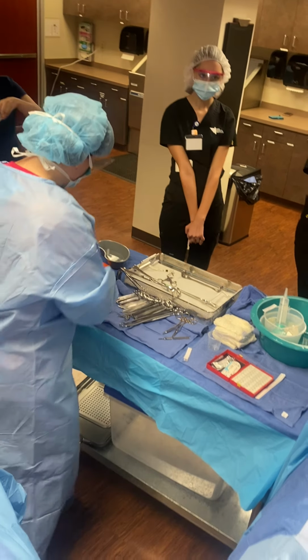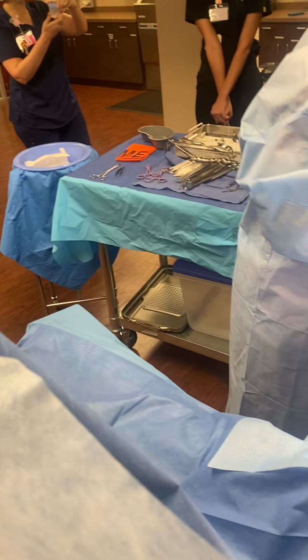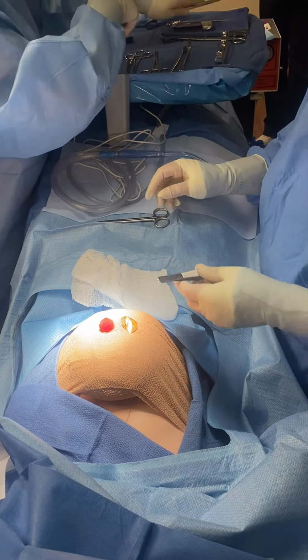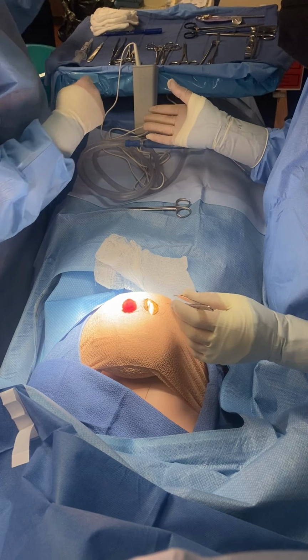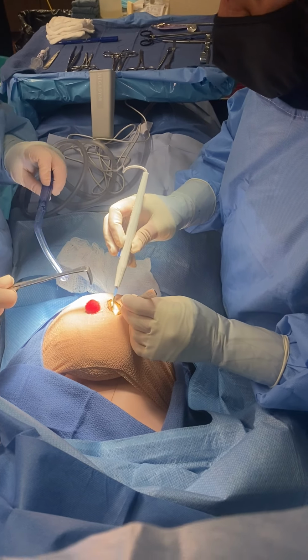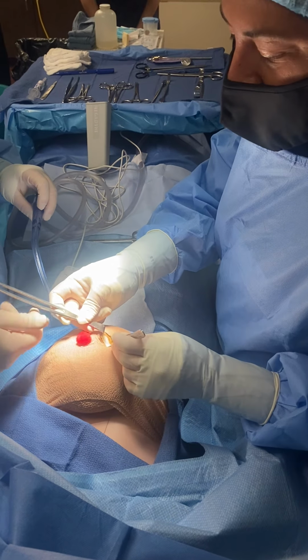And that is exactly how it would happen. It would stick. And this is labeled anterior margin? Yes, please. All right. Let's take a look, Bobby. Okie dokie. Let's see. Margins are good. Oh, yay!